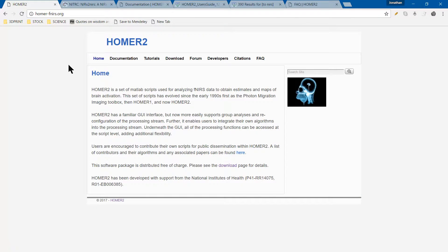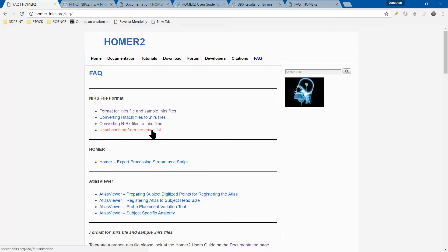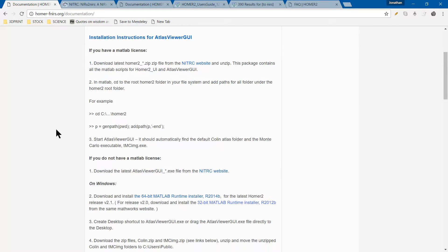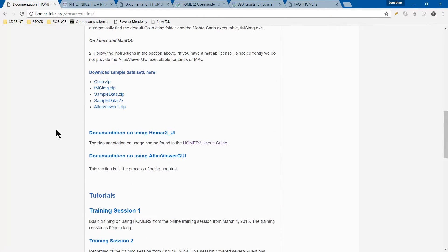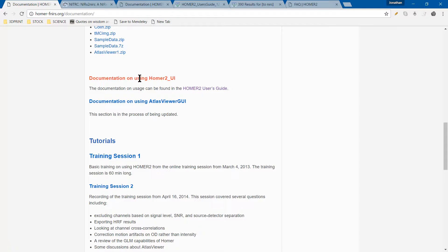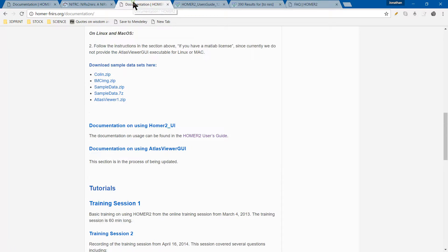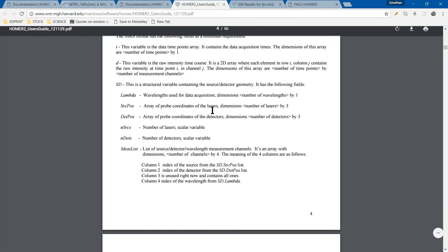If you go back to the Homer website, homer-fnirs.org, go to the FAQ section, and when you go to the FAQ section, you'll see the conversion files here. If you click on documentation, just to give you an idea of what the format actually looks like, scroll down to where it has the documentation on using Homer 2 UI, go to the Homer user's guide. That'll actually get you right here.